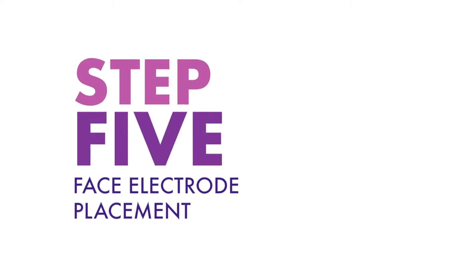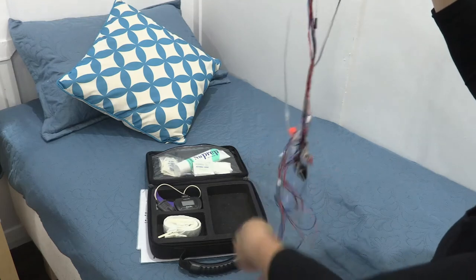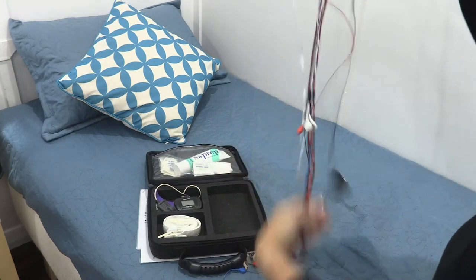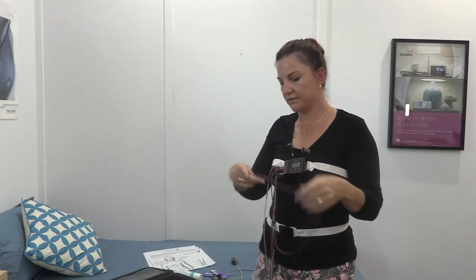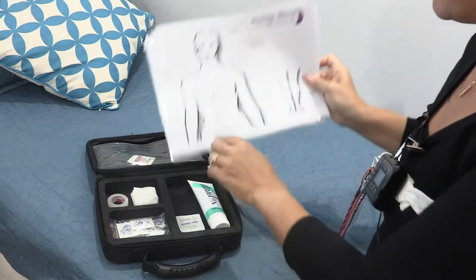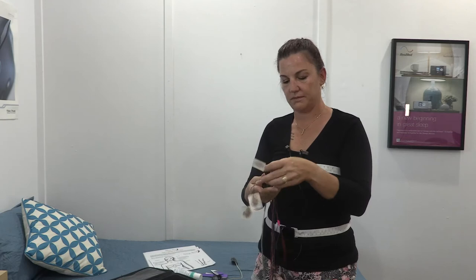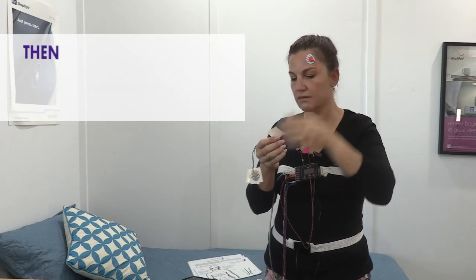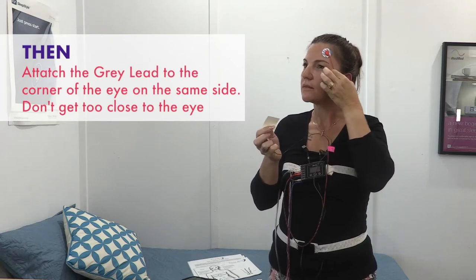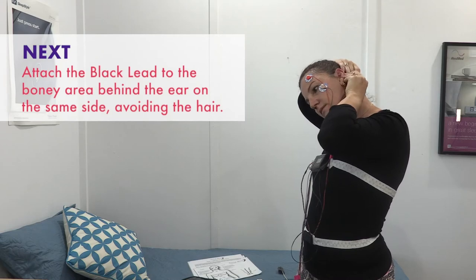Step five: face electrode placement. These signals will determine if you are asleep and what sleep stage you are in, and are vital for a successful study. Already attached to the machine you will see two sets of three multicoloured plaited leads, one white set of two plaited leads, one single lead, one orange twin lead and one very long twin lead. On the sets of three plaited leads you will see a tag with an L or R written on it, meaning left or right. Refer to your manual for exact placement if you need to. Grab the first set of multicoloured leads and attach an electrode to the end of each lead, ready to place on the left or right side as marked on the tag. First, attach the orange lead to the outer forehead. Then attach the grey lead to the corner of the eye on the same side, making sure you don't go too close to the eyelid. Next, attach the black lead to the bony area behind the ear on the same side, avoiding the hair.